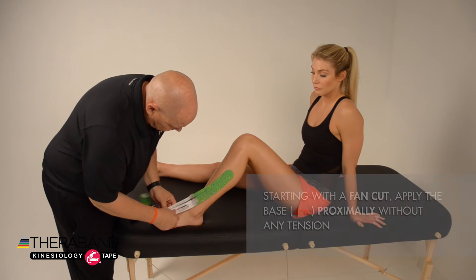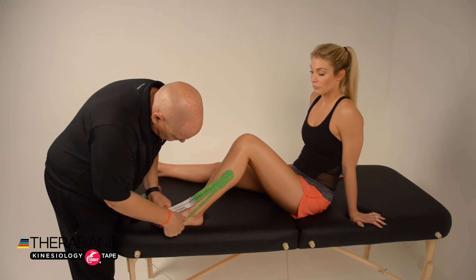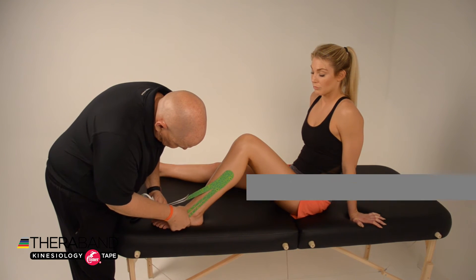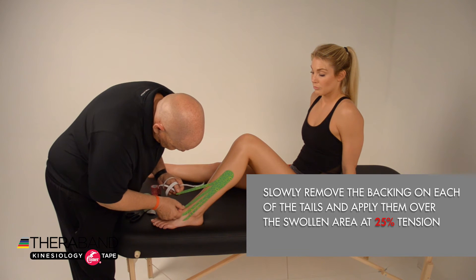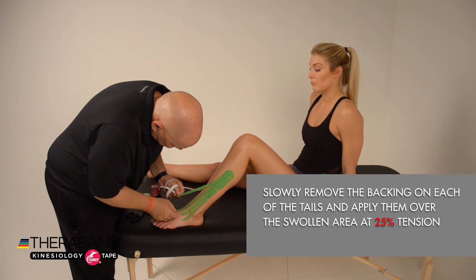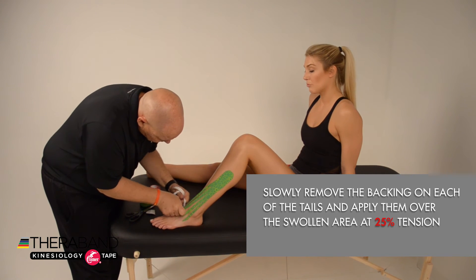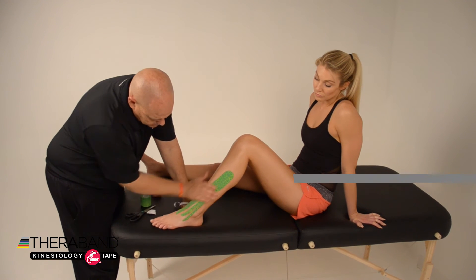Then slowly remove the backing from each of the tails, leaving a couple of centimeters on the end of each tail for the distal attachment. Apply those tails over the area of swelling with about 25% tension, and apply the ends without any tension.